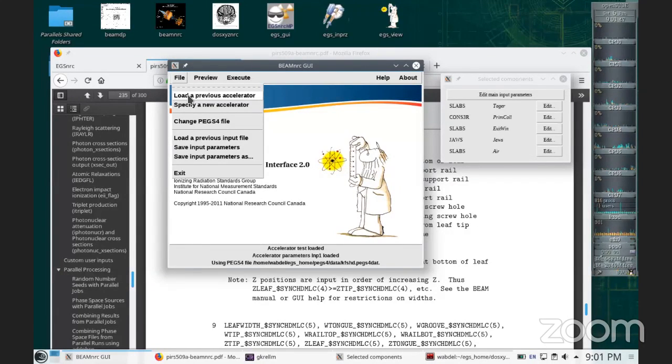So try to get the information about your beams. Even if you have an X-ray tube you want to model, get the information about the X-ray tube. And probably next time, if you post this information, we will try to model it and create it.